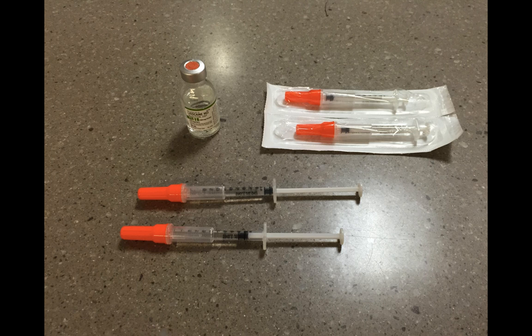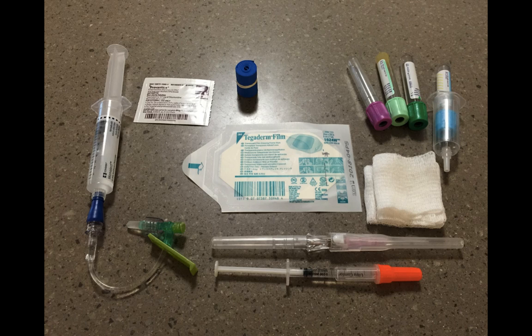One of the main differences I can bring to the table is using numbing, because patients who've been stuck six times often won't allow anyone to stick them anymore. But with a little lidocaine, that's mitigated and they're more than happy to let you find the vein. Use a TB or insulin syringe — the smallest gauge you have. Put it all together first so you're not fumbling under pressure. Connect the saline to the luer lock and flush it, pre-draw the lidocaine, and have blood work already set up with the correct tubes.